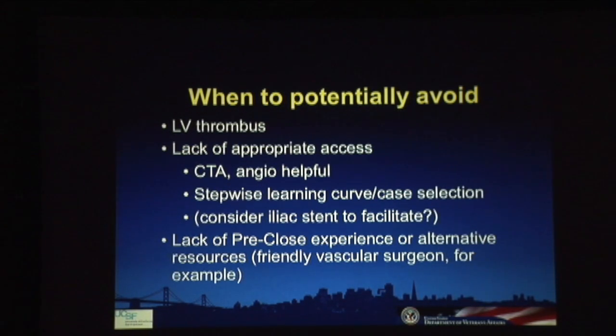I find that if we have a CTA, it's very helpful. Sometimes we do an angiogram at the time of the cath, or they've had one at another time. Even just a peek at the groin from a prior cath is very helpful to plan that. There is, of course, a stepwise learning curve, and there's case selection for everybody, so on the first cases, or the cases where you're learning to do this, you want to make sure there's adequate access.